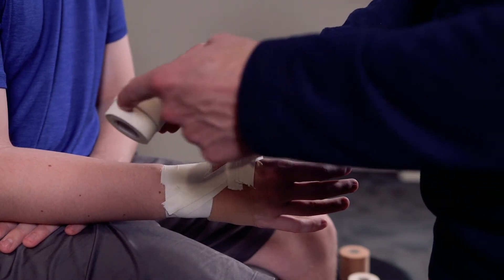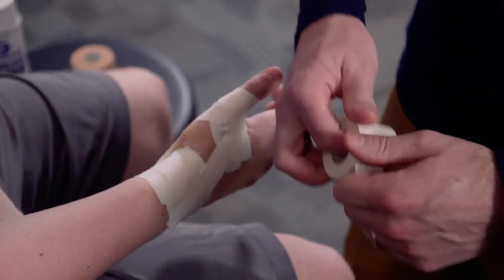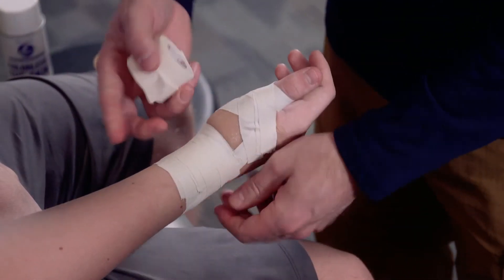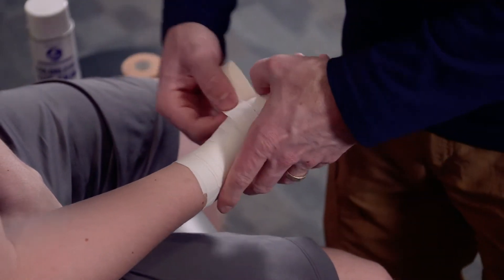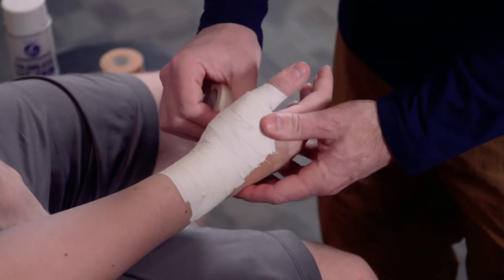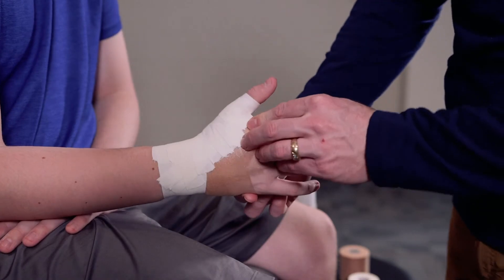Now you can see I've got all my half strips taken off of one side. I'm going to go over to the other side and start taking off the rest of the half strips. I'm going to go now from anchor to anchor going down, crossing and overlapping by half, continuing to go over and over again, covering all of those pieces, going as far up on the thumb as we can before we can't really go anymore, and securing that down into place.